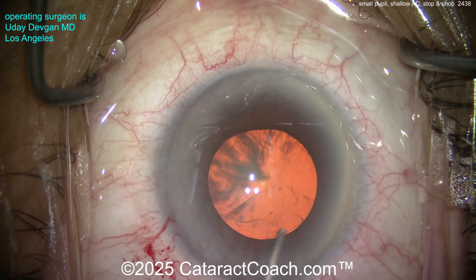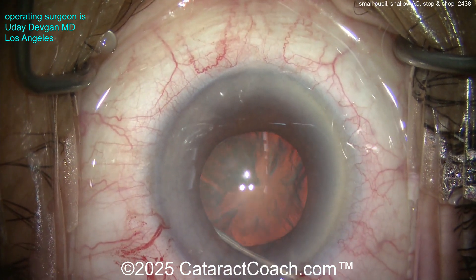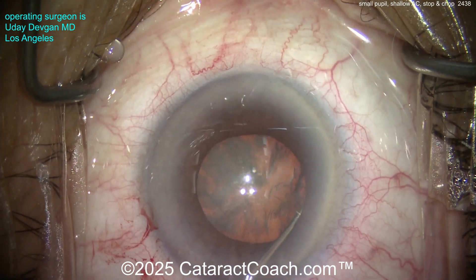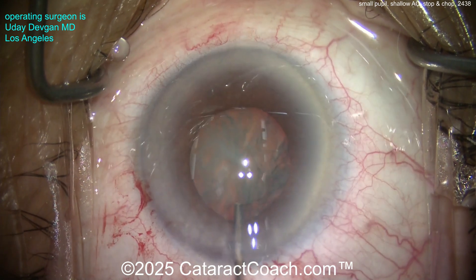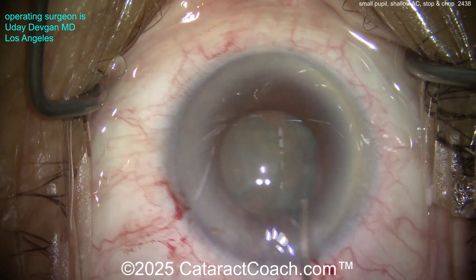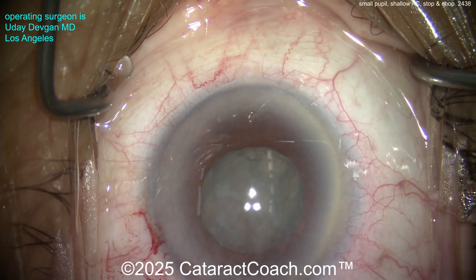I'm not going to prolapse the lens out of the bag — the AC is just too shallow. This is a high hyperopic patient, so instead we'll do some gentle hydrodissection. I'll also blot the central nucleus from time to time because I don't want to build up pressure. Just tiny aliquots of BSS, enough to get some hydrodissection, tapping the central nucleus. I don't want to bring the nucleus out of the bag — keep it in. Now, the saying: 'if it does not spin, you will not win.' I want this thing to spin — and there it is.